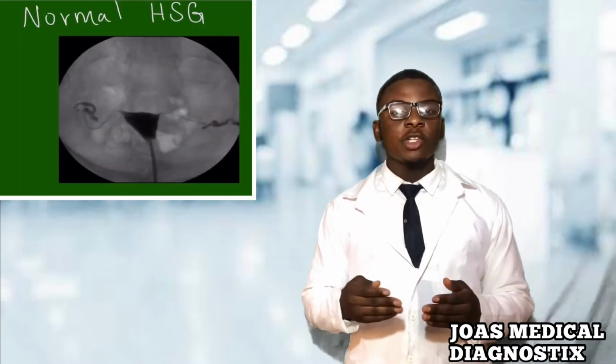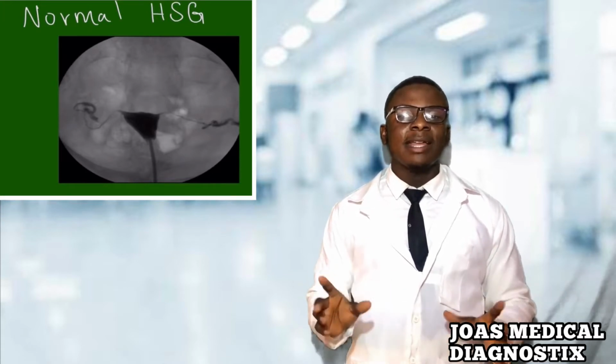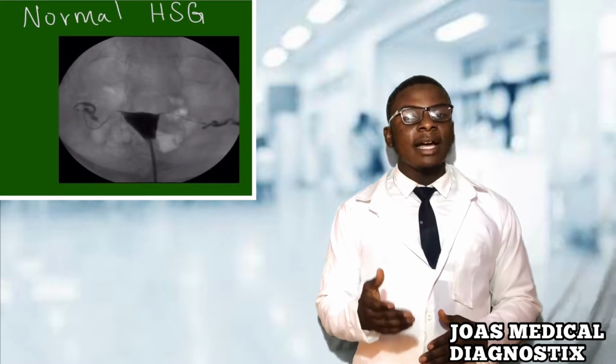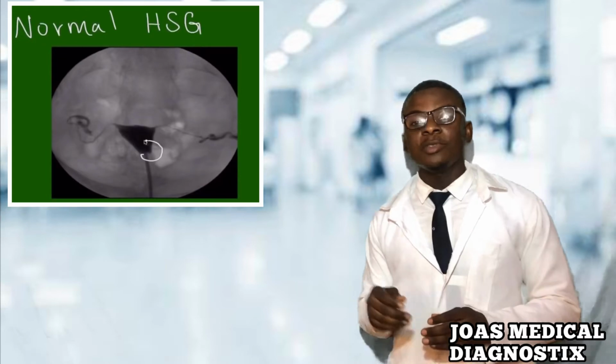This is a picture of a normal HSG and it gives the opportunity to review the pelvic anatomy as seen on imaging. Remember that an HSG is a minimally invasive diagnostic procedure in which we inject radiopaque contrast into the uterus very gently and take pictures in real time with fluoroscopy or statically on X-ray to diagnose abnormalities of the female upper genital tract. The first thing we see is the catheter in the lower uterus.